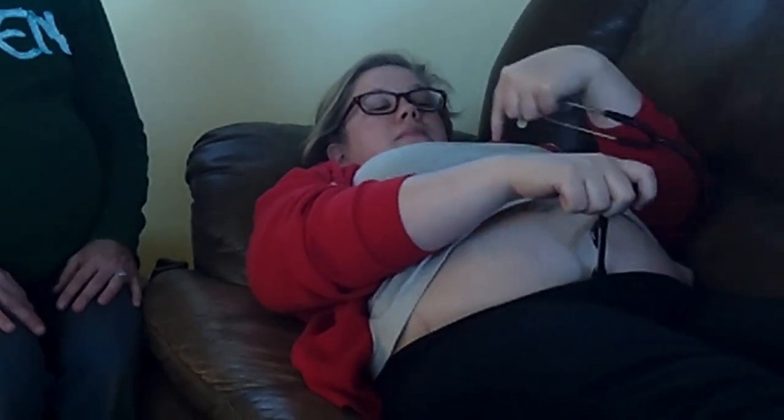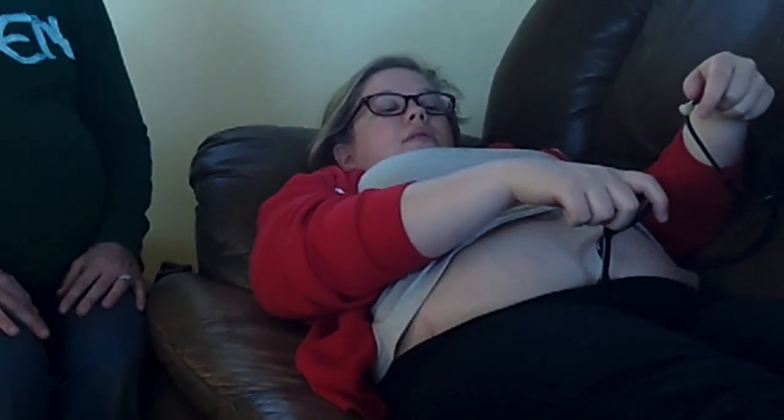And usually the best place to listen for baby is sort of central, in the middle of your body, if that makes sense. Just because your uterus really isn't that wide at this point anyways, so there's not that many other places for baby to be. But of course, listen wherever you think, listen all around, can't hurt anything.